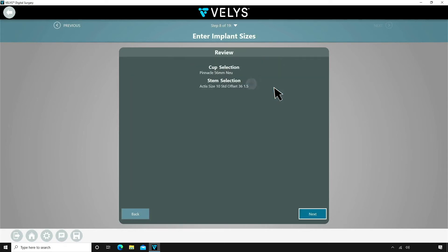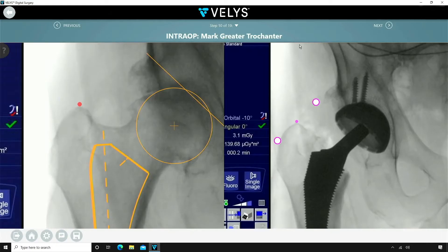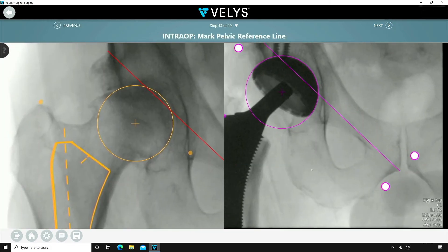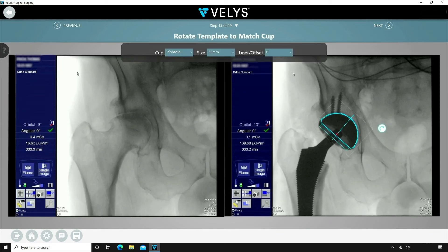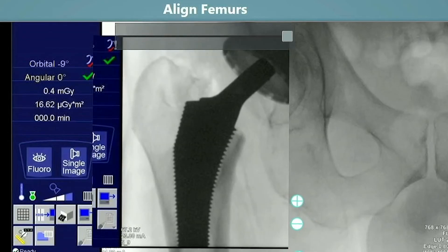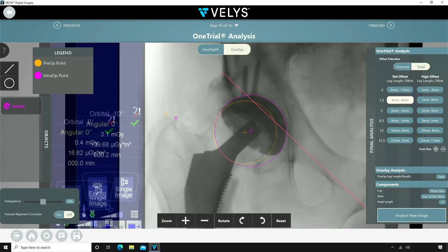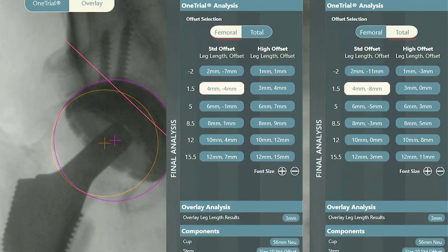Once the trial is in place you then obtain another AP hip image. This is then used by the sales consultant to register the reference points. You then run the Velis software and a one trial chart is generated. This chart demonstrates the modularity options of the selected hip implants and their effects on leg length and offset.